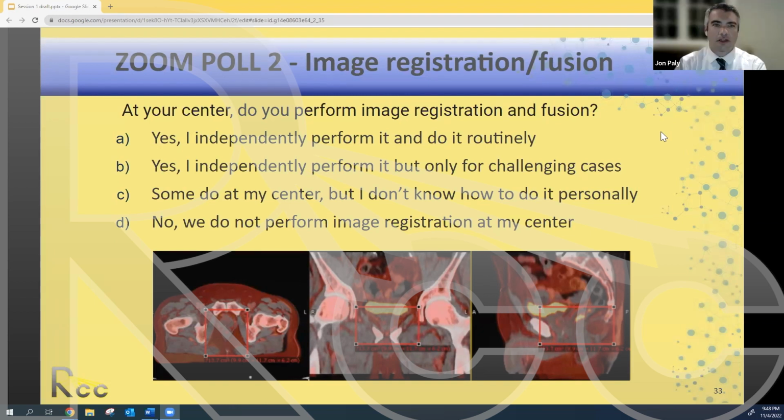And I think to touch on the other question, I suspect what they're referring to is, do we worry about contouring on a contrasted scan and having the altered densities in that scan affect the radiation planning process as far as the Hounsfield units being different? That's a very good question, and one that I've asked physicists several times.